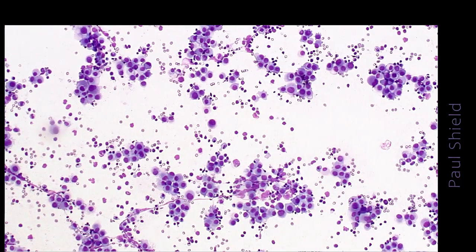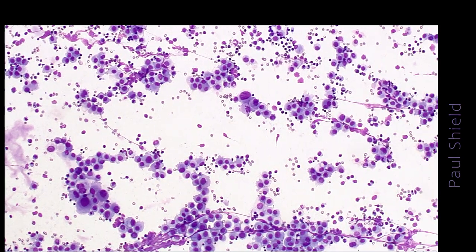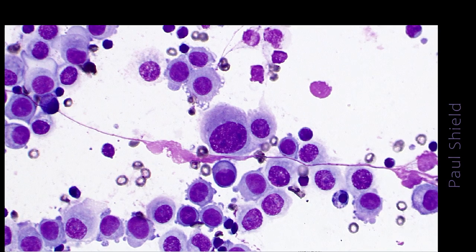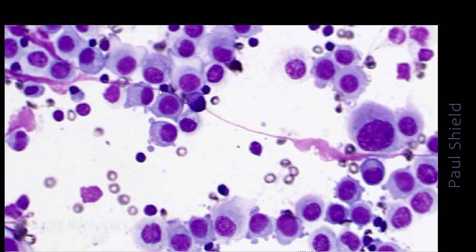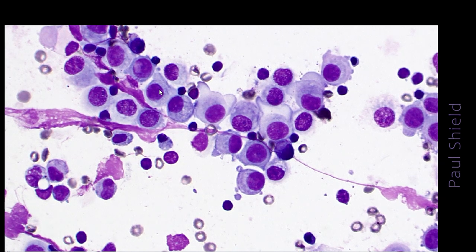Here's another case, and so not all adenocarcinomas present in very cohesive balls of cells and acini. This is one that's showing less cohesion, and so there are more singly arranged cells, and this can be quite tricky. Notice I've got marked nuclear atypia here, and variation in nuclear size and shape, quite a big one in the middle there. And then if you look around, these cells aren't really mesothelial, so I can't see windows in between them. And if I look at this group here, notice the edge of the cells are not in fact frilly at all, lacy. So these are not looking like mesothelial cells to me.